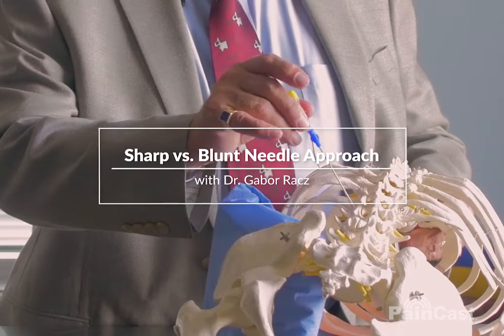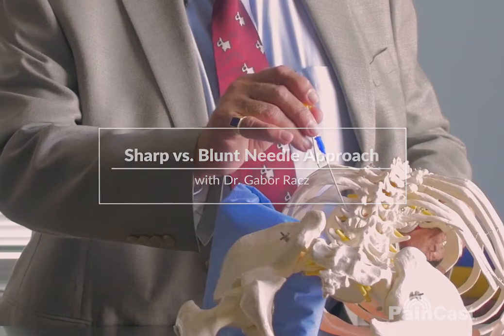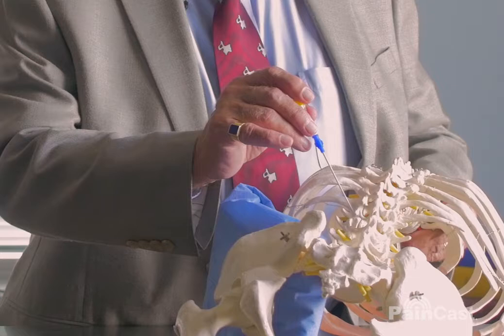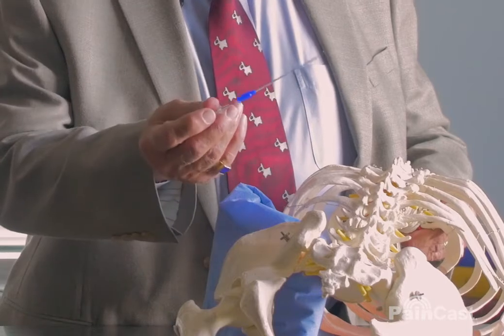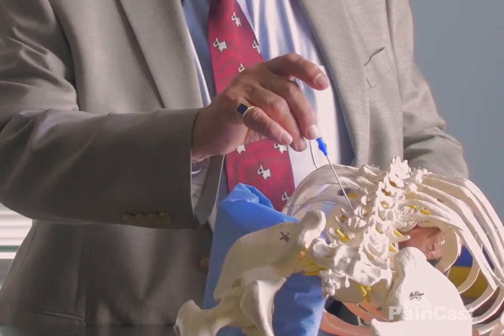On lateral view, if you run into a nerve root that is stuck down — adhered — it doesn't give. When you start causing pain, just pull back and redirect with the curved tip. You can rotate it, and then go all the way to the bone.